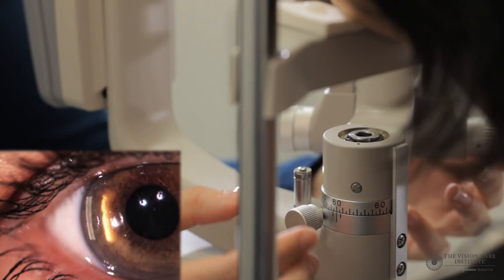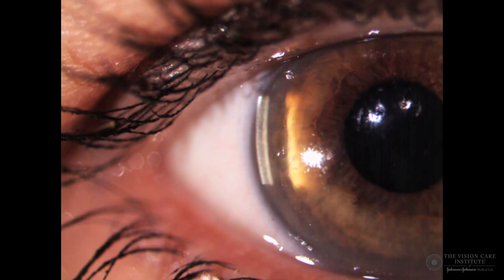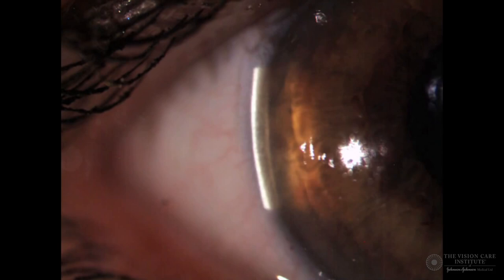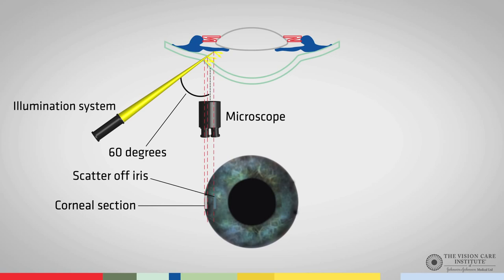It is important to have the section on the very edge of the cornea, and then we can increase the magnification further. Here, we have both the corneal section and the scattered light off the iris parallel to each other. This is achieved because we reduced the slit height and will make the assessment more accurate. The illumination system is directed at an angle of 60 degrees, forming a corneal section. The light, after passing through the clear aqueous, strikes and scatters off the iris.